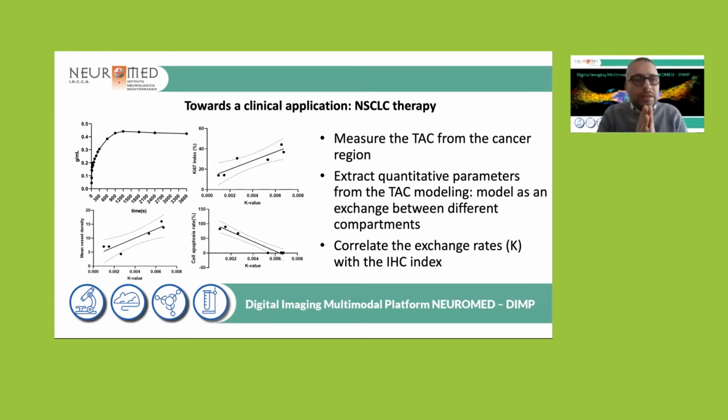In that case, the interest is in how the cancer is taking up the tracer with time, and you may do new modeling for that. That's an example of how that specific cancer takes up tracer with time. You can apply specific modeling and extract quantitative parameters from TAC modeling.